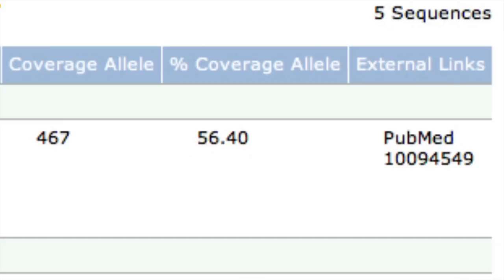The patient is heterozygous. A review of the literature indicates that this mutation is autosomal recessive. Therefore, the finding is that there is no genetic pathology for the patient, although there is certainly an implication for the family.